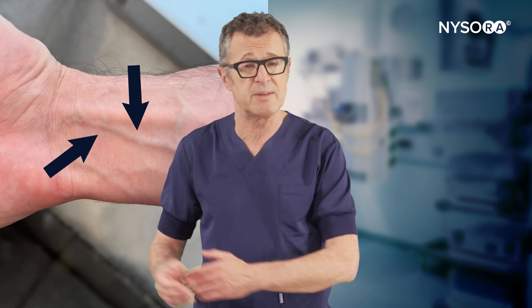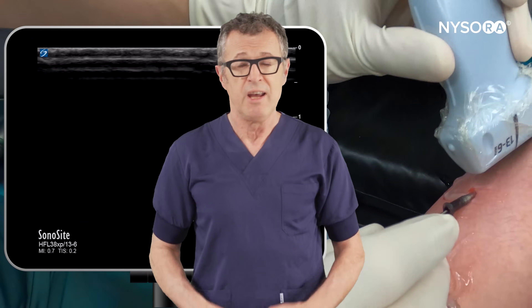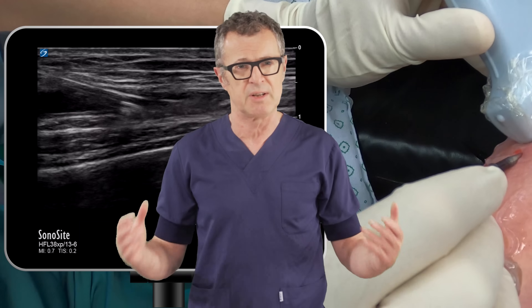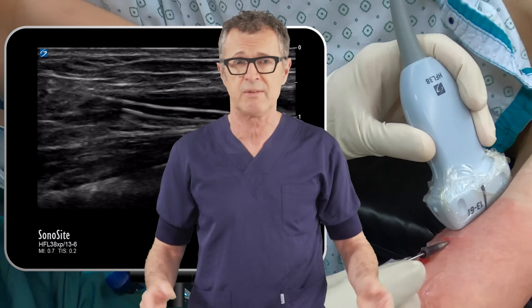While ultrasound may not be the best tool for cannulating superficial veins, it is indispensable for larger, deeper veins. In this video, we will describe an out-of-plane technique of inserting a 16-gauge catheter into a brachial vein using ultrasound guidance.